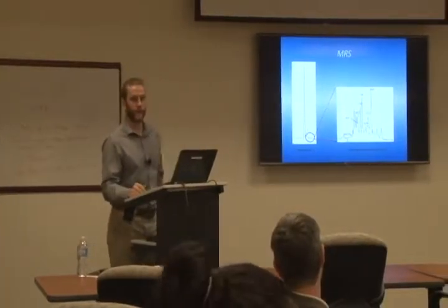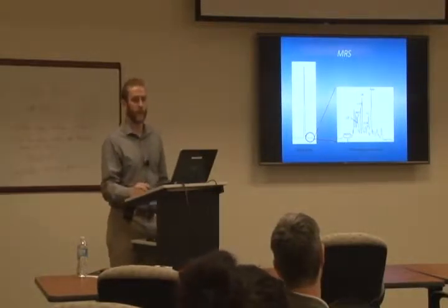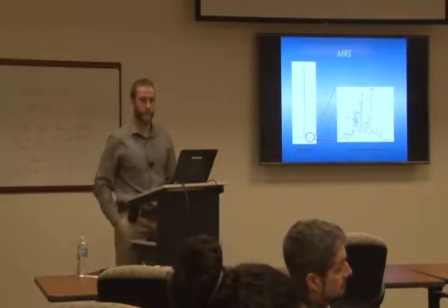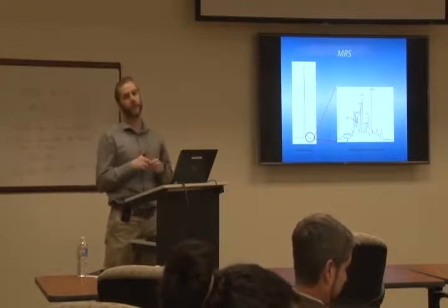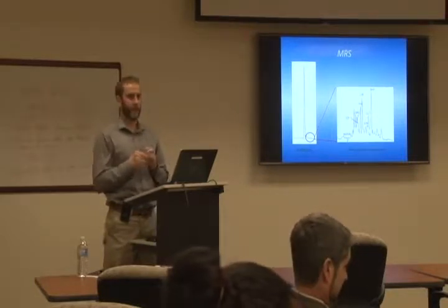Kurt and I have looked at the glutamate peak, and it's kind of as you say. Sometimes it seems like we have two distinct peaks, and then the next time I scan myself yet again, we don't. So I would say it's not particularly reliable.